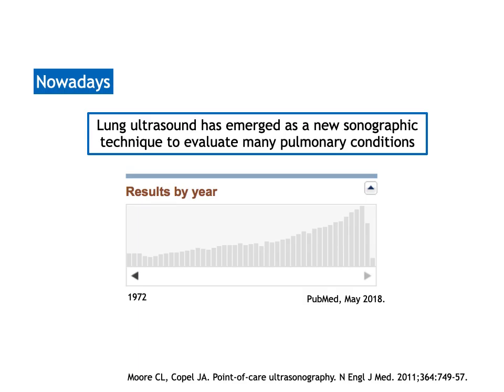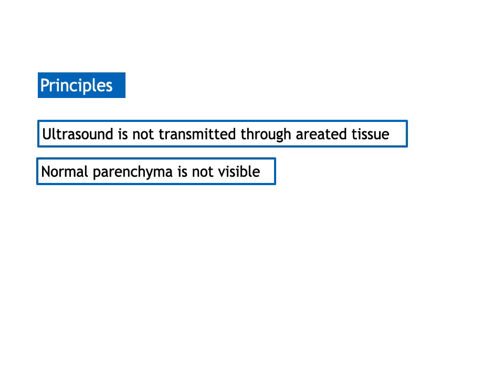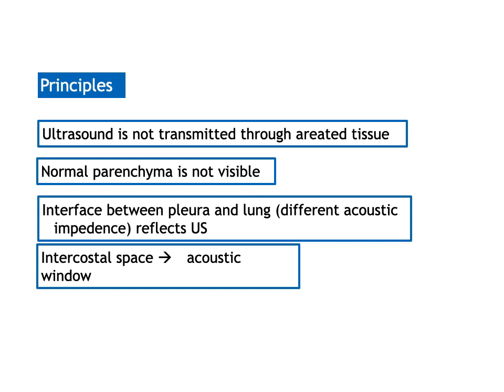mechanical ventilation. And interestingly, if we look into the literature published online, we can see the exponential increase in the number of publications. If we put the words lung ultrasound in the search box on PubMed, we will notice the significant increase in the number of publications in ultrasound. So the principles of ultrasound, I'm sure that many of you are quite familiar with that.